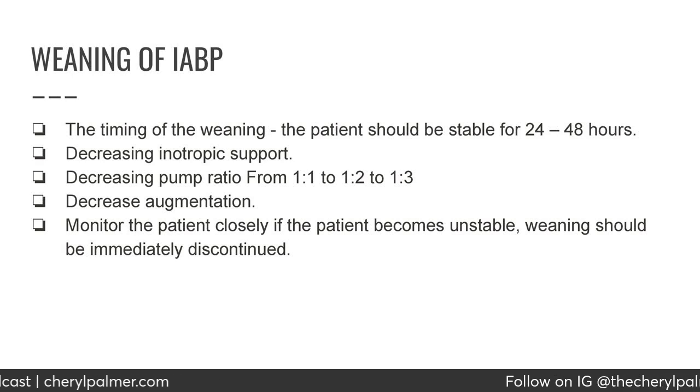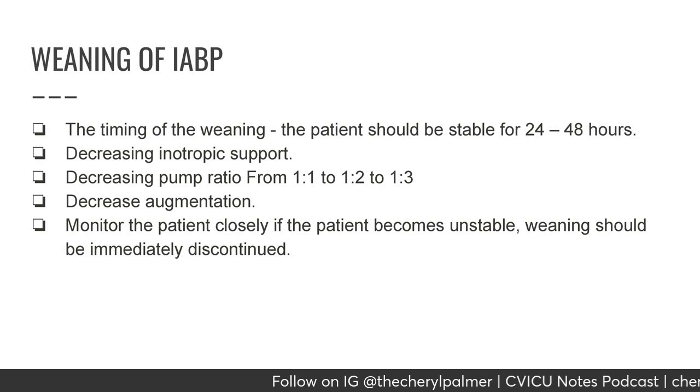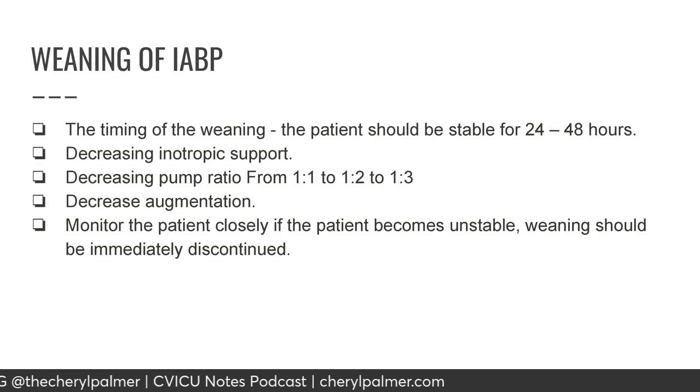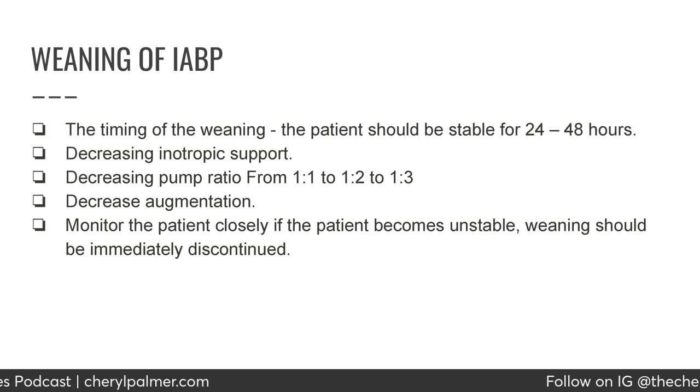A lot of centers do 1 to 1, to 1 to 2, and then they take it off or DC it. Decrease augmentation. Monitor the patient closely. If the patient becomes unstable, weaning should be immediately discontinued.